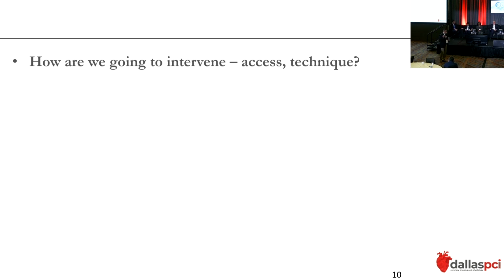So he has the Impella in his right axilla, and obviously the right femoral artery, right radial artery is not an option. And his creatinine got better, 2.2.